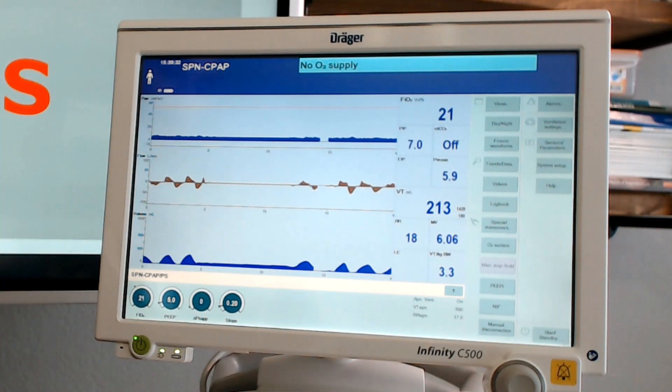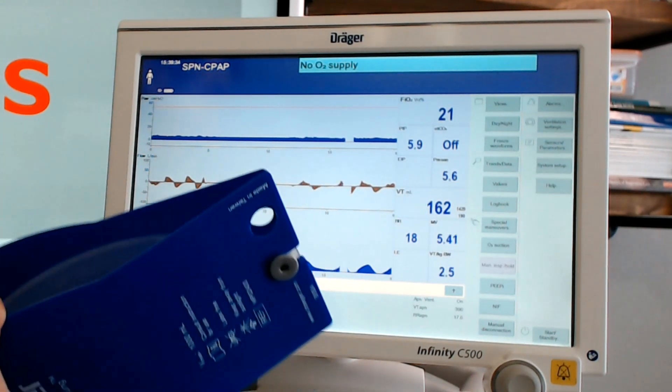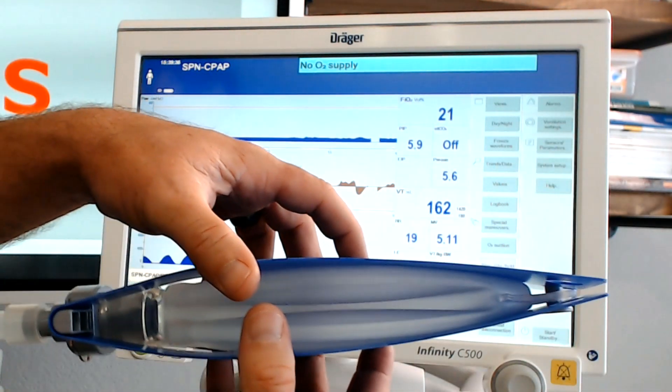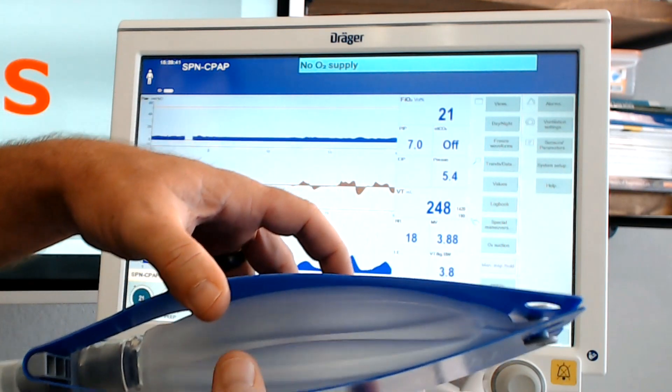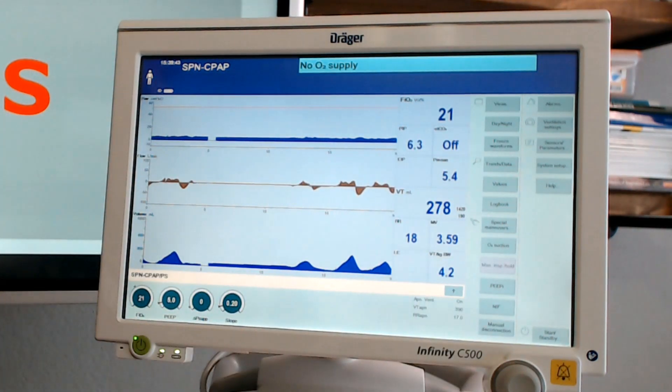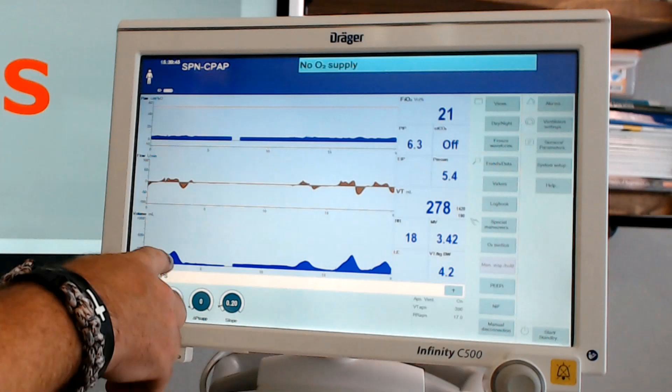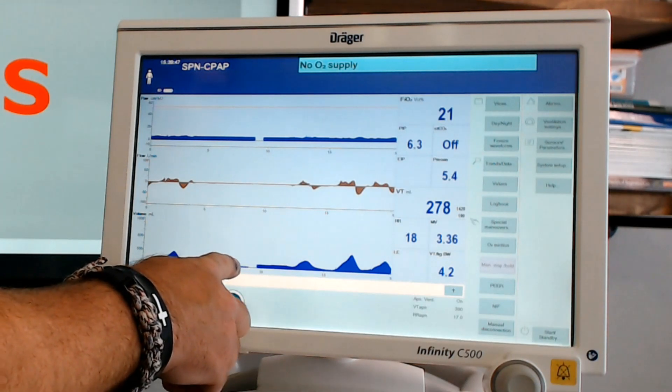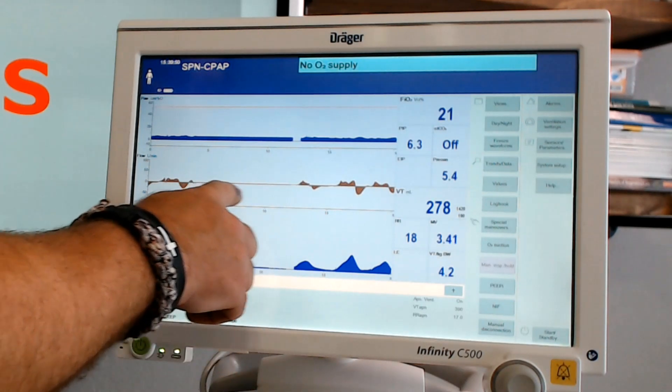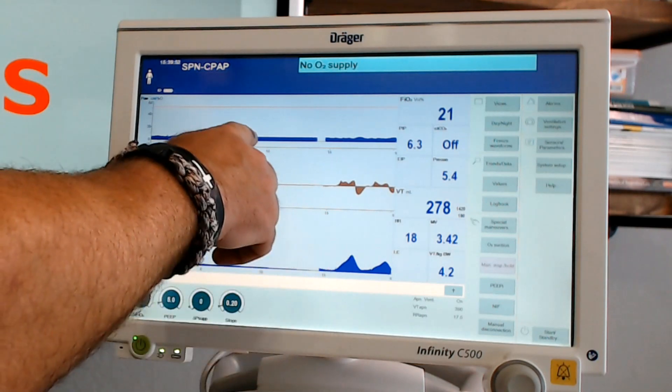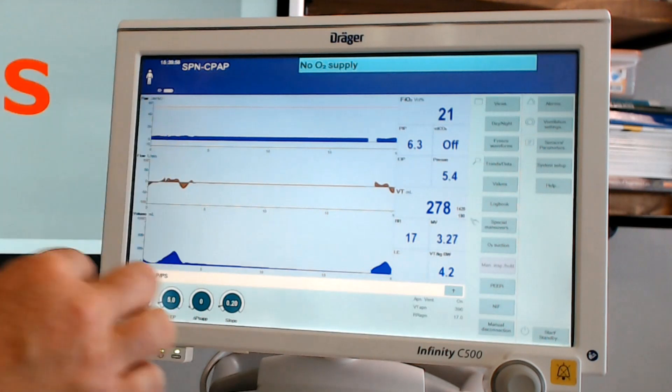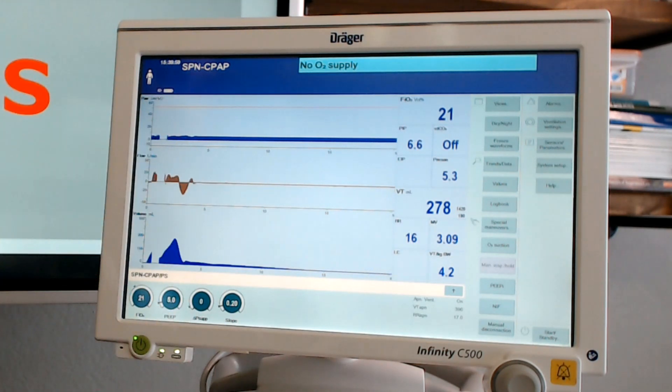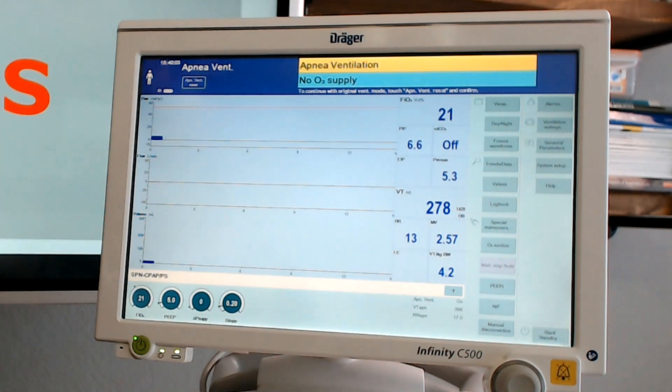Now the first thing I want you to notice is that if I don't pull on this test lung, all I'm doing is just pulling on this test lung, creating a negative pull which is simulating a breath. If I don't do that, look what happens. There's no flow. There's no volume. There's nothing because in CPAP, if the patient doesn't generate a volume, then there will be no volumes delivered.